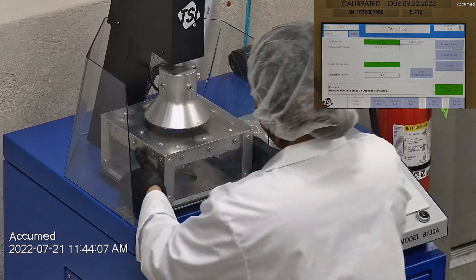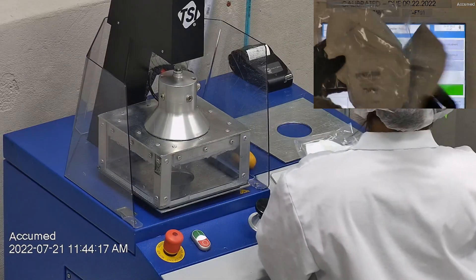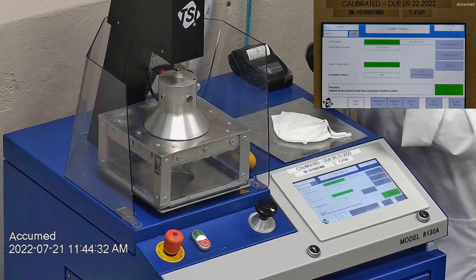We're going to be testing both the filtration efficiency and pressure drop. This is our TSI machine model 8130A, which is also the same filtration testing machine that NIOSH uses to approve N95 respirators. Our procedure is also inspired by NIOSH.